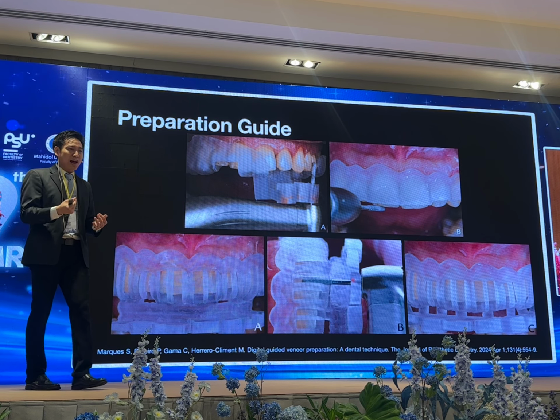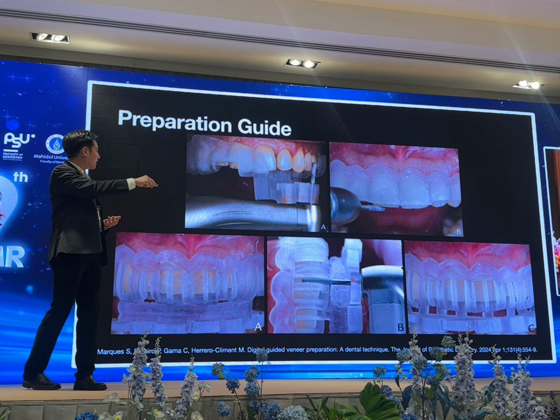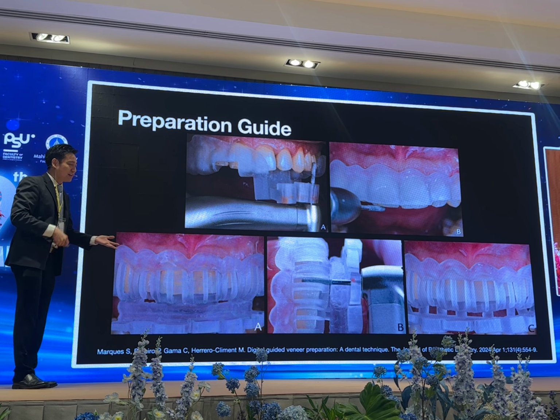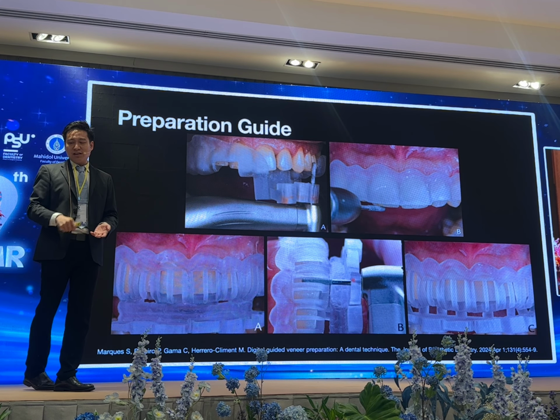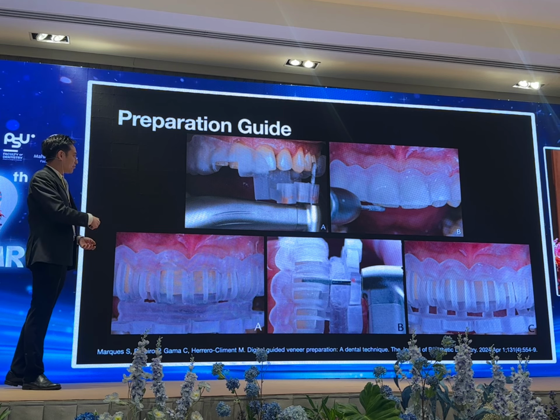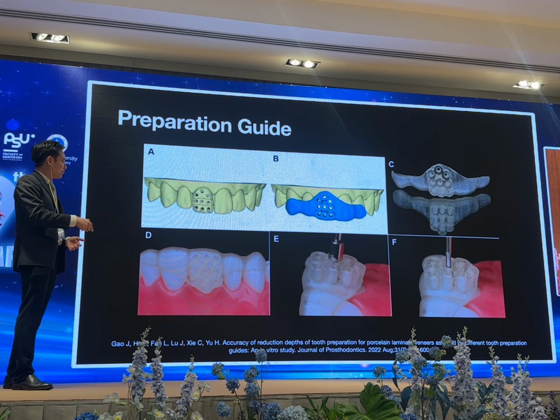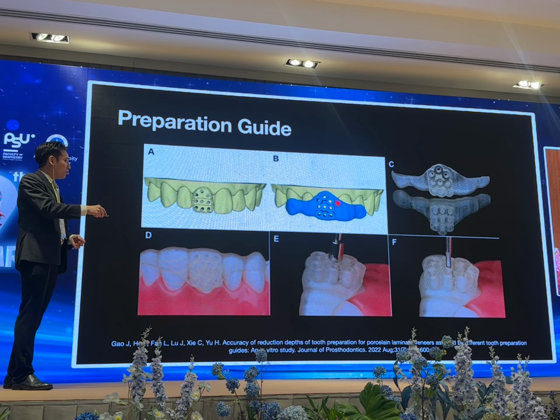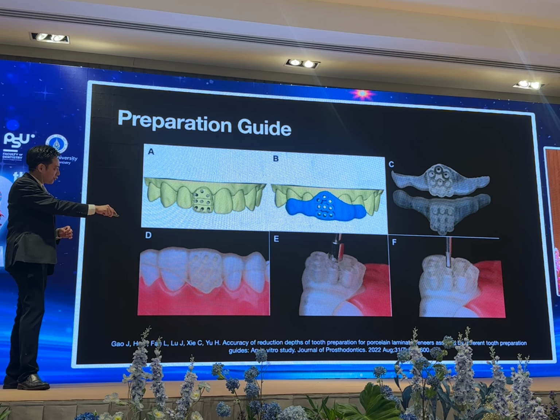And plus, sometimes when you do preparation, there's not enough water coolant, because the guide will block water from your handpiece. So right now there is not a gold standard guide for the preparation yet, but there are so many proposed designs. This is another design for the guided preparation. They made a hole for the specific burr. This one is an auto stop.